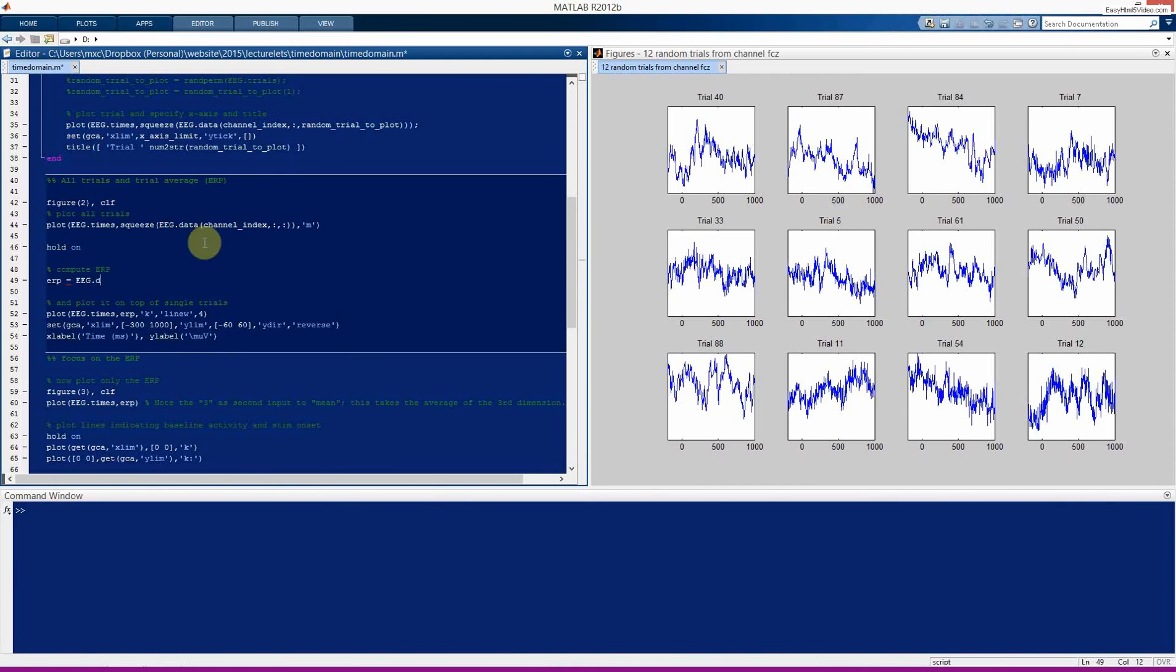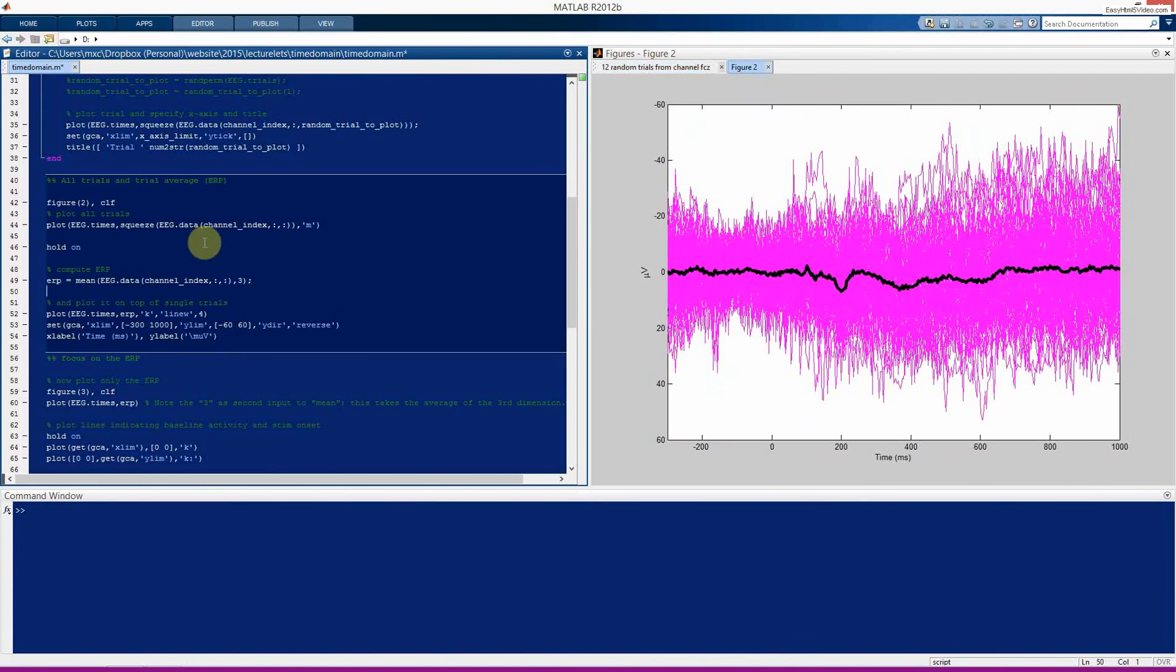So here's the solution, we want the EEG.data, we want the data from this channel, all time points, all trials. And now we want to take the average over the third dimension, it's the third dimension, because the trials are stored over the third dimension. So now you get this nice plot, which reproduces the figure I had in the PowerPoint, except this has slightly nicer colors.